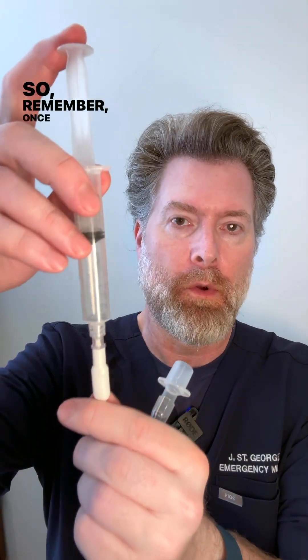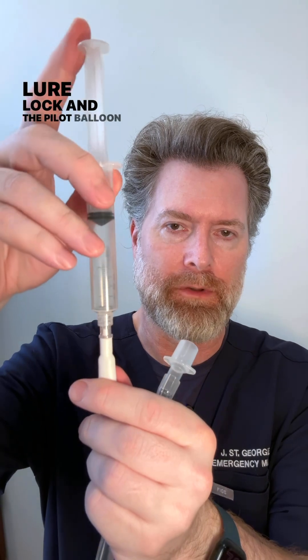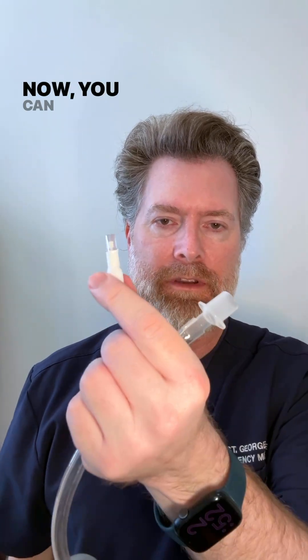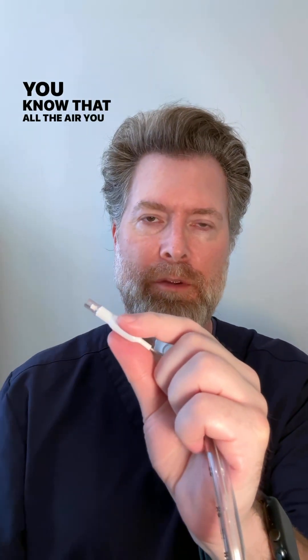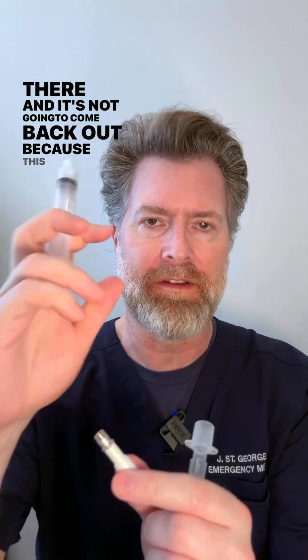Remember: once you've attached the 10 cc syringe to the luer lock and pilot balloon, go ahead and insert the air and then immediately twist it and remove it. You can then squeeze this little ball and feel that there's air in here — confirming there's no tear or leak in the cuff, and that all the air you put in is staying in and not coming back out.